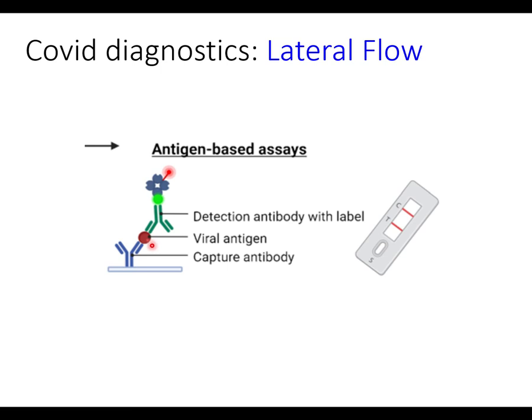As long as you've got access to the viral antigen, which after all will be on the outside of the virus because it's the viral spike protein in many times, then you don't really need lysis, but lysing the sample to some extent will increase efficacy as the number of antigens available will increase.